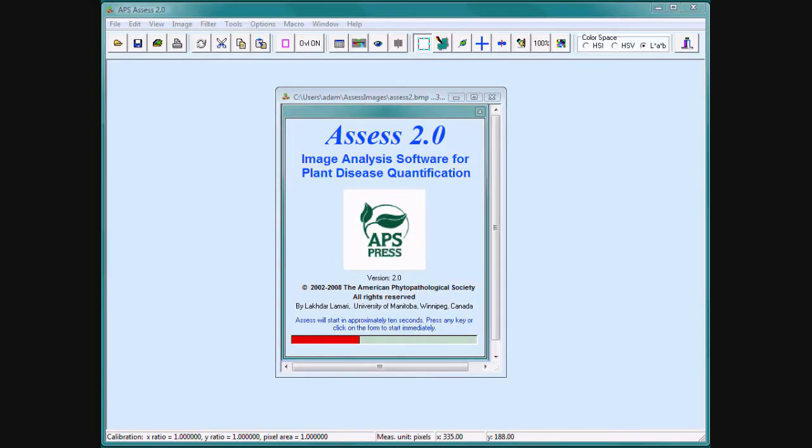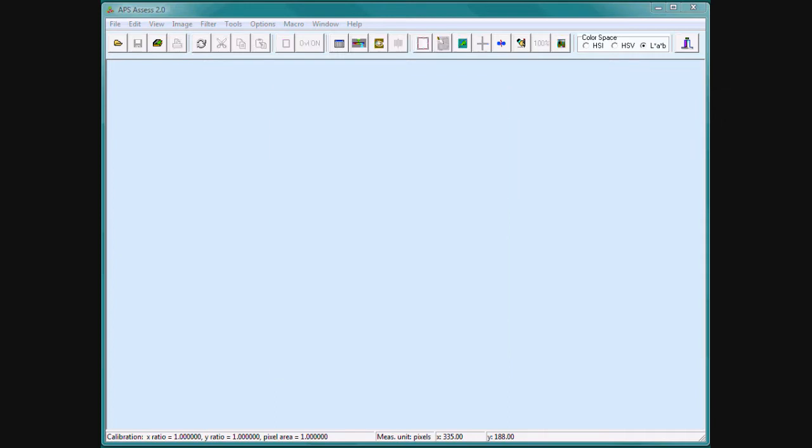Welcome to Assess, image analysis software for plant disease quantification. During this presentation, we will show you how to use Assess to easily measure plant diseases and perform many other tasks.